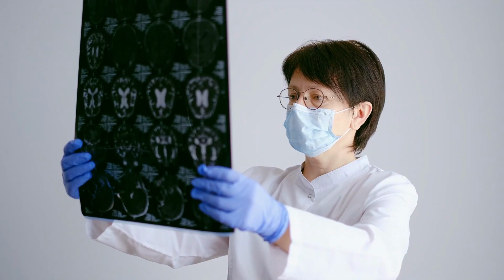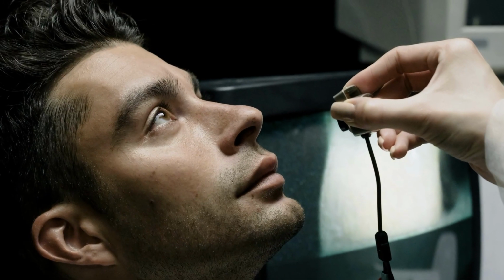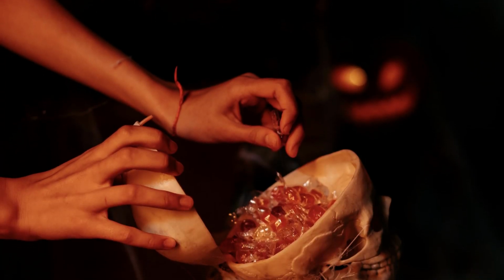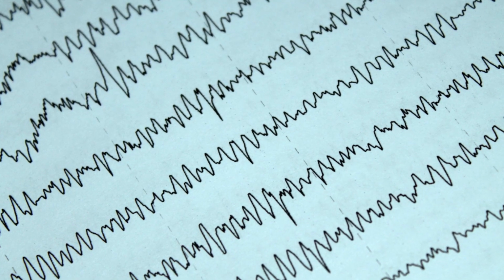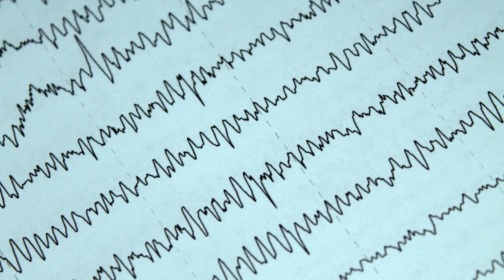So, according to this theory, an EEG is a machine that can record electrical signals traveling through the fluid-filled extracellular space in the brain, or, in simpler terms, able to record electrical brain activity. This is done with electrodes attached to the subject's scalp, if done non-invasively, or subdurally or on the cortex itself, if done invasively. Overall, an EEG is a neuroimaging process used to evaluate electrical brain activity and, therefore, dynamic cerebral functioning.